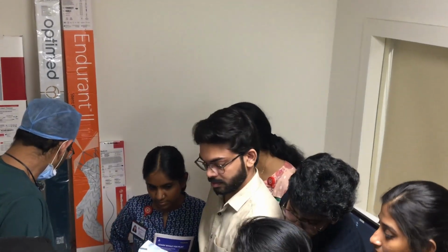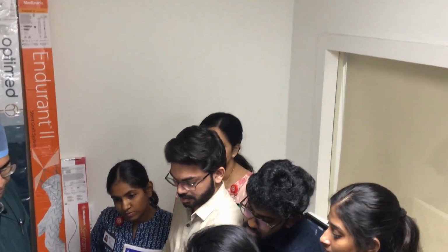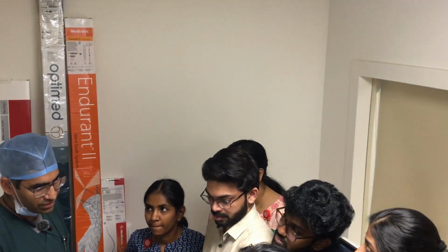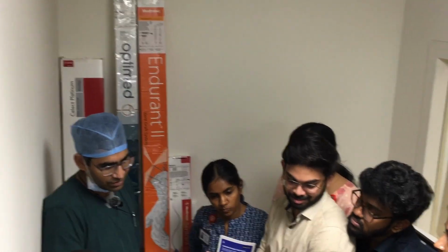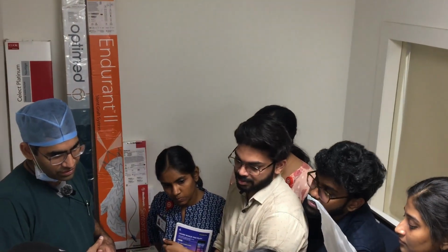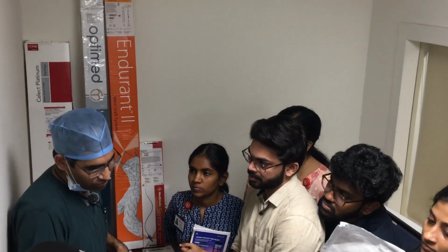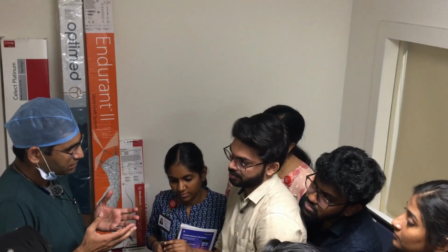Okay. Then there are, once you have this one, it comes with a wire. So for the microcatheter which does not have a wire, we have to see what wire it takes and take the appropriate wire for that. Okay. So the wire and braid, grossly 2 sizes.